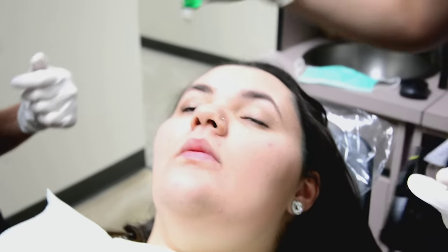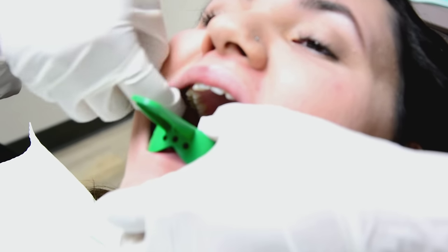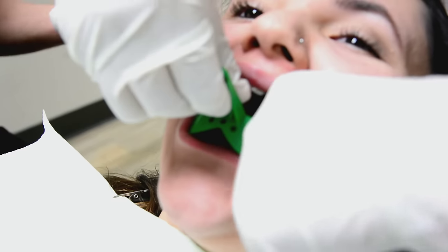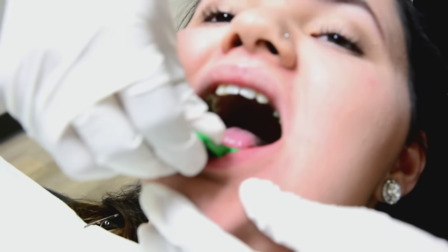Let's try the tray in just to make sure that it fits — your assistant can do this, it's very simple. You want to make sure that the tray fits over all the existing teeth, just as though you were doing a preparation for crowns. Is that comfortable? All right.